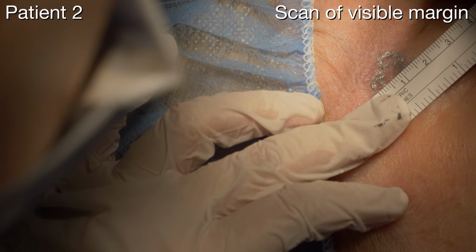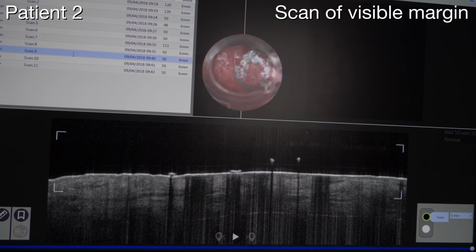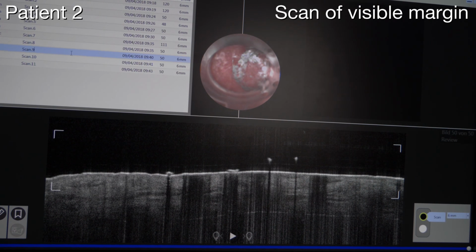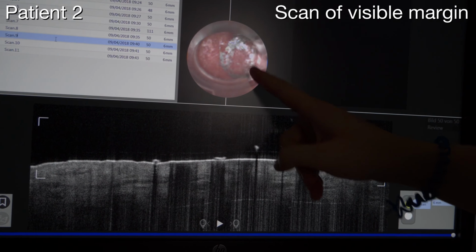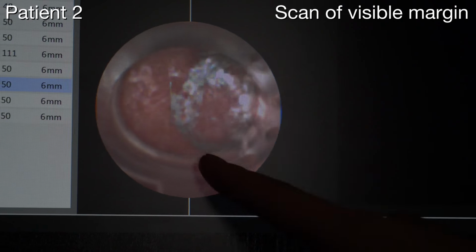So you're adding 2 millimeters? Yes, I'm adding 2 millimeters. And when we saw it on the picture, it's between 9 and 12 o'clock. And here we have a very nice example, because here on the clinical image we have the first drawing with the pen and the second.